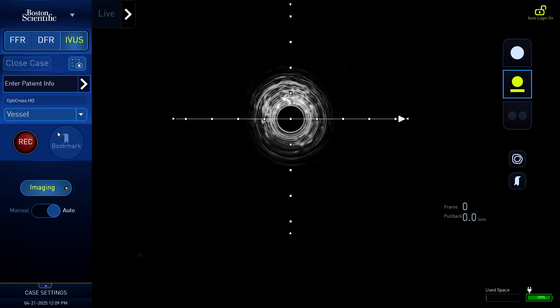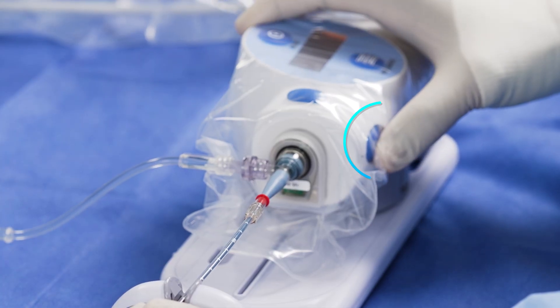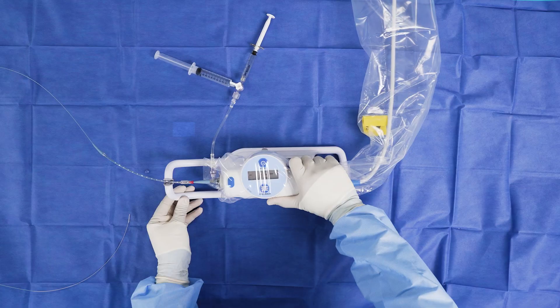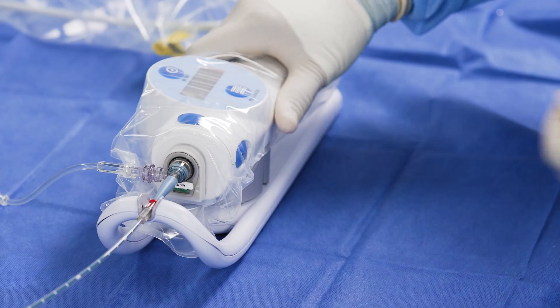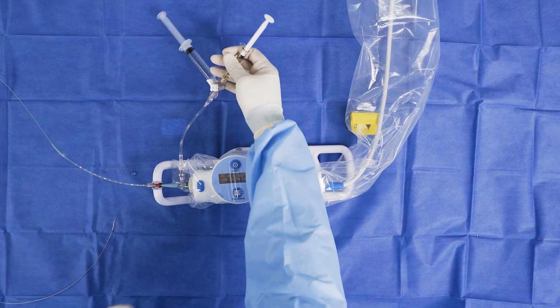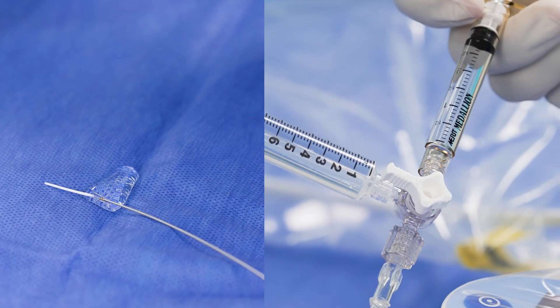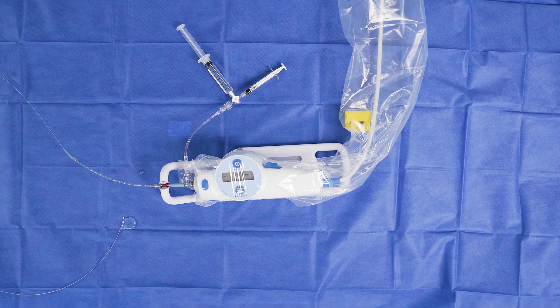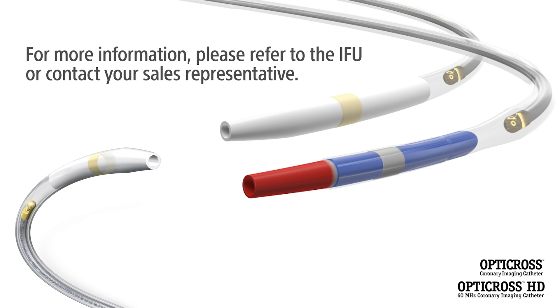The system will show bright concentric rings confirming that the catheter is functional. Turn the imaging off. Carefully advance the MDU to the forward position on the sled and clip the proximal end of the telescope to the sled. Perform a final 3cc flush of heparinized saline. The catheter is now ready to use. Follow the prescribed steps in the instructions for use to introduce the imaging catheter into the guide catheter. Proper preparation setup reduces the probability of air bubbles in the catheter.